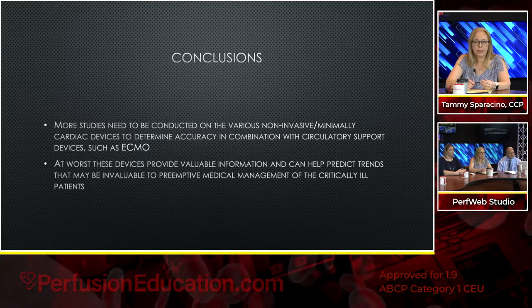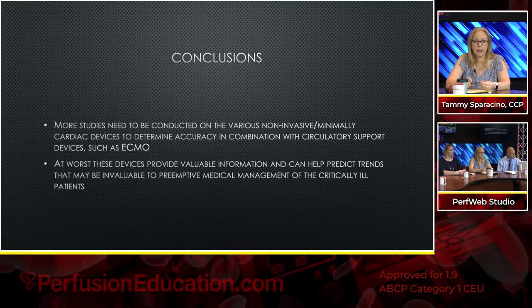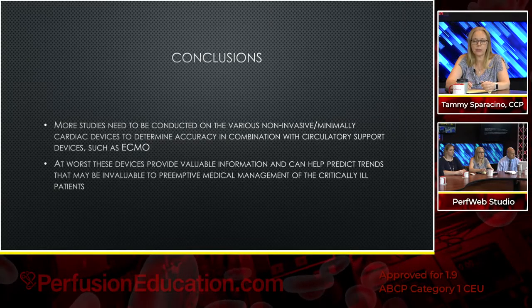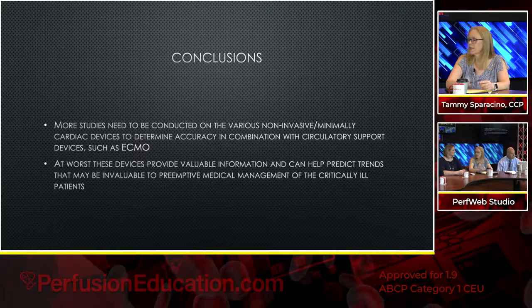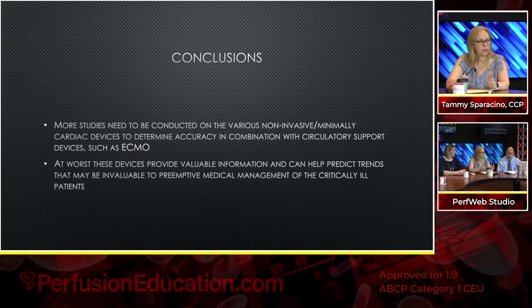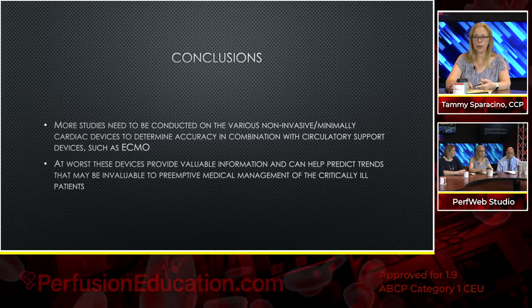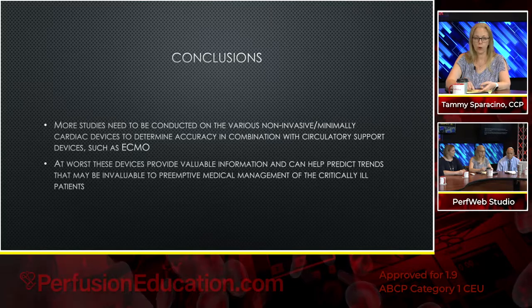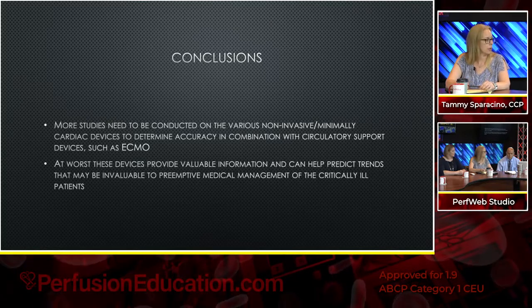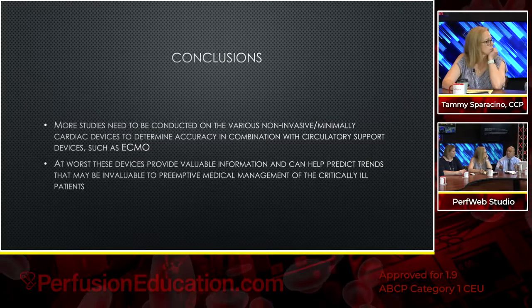At worst, these devices provide valuable information and can help predict trends that may be invaluable to preemptive medical management of critically ill patients. But again, just as you said, I think it's really important that you're not relying on this, for the most part non-invasive, device to determine exactly what you're doing. It's just one piece of the puzzle to help you get a better idea of what's actually going on in the patient. It's very good. And I do think, very good, by the way, very excellent.